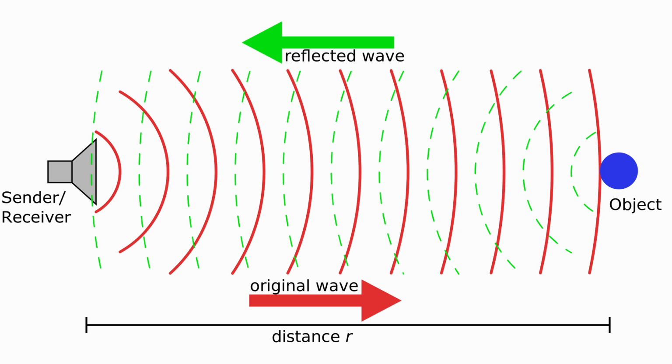It's important to have a basic understanding of how ultrasound works. You don't need to know the great details about it, but in general, there is a sender and a receiver, and that's all housed within the ultrasound probe. Most ultrasound probes used today have an array of crystals that send out an ultrasound signal. That signal hits an object, and based on the power of the wave coming back and the speed the wave comes back, it then will project a picture onto the screen with varying degrees of what's called echogenicity, which is seen as brightness or darkness, and that will tell you what you're seeing below the surface.